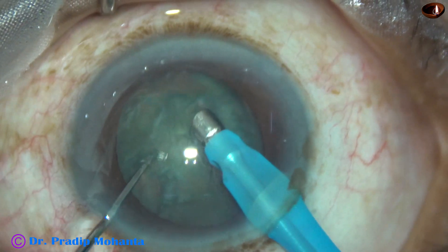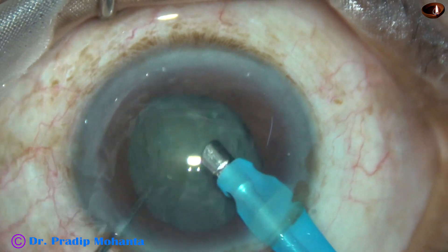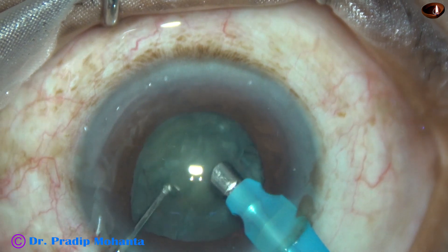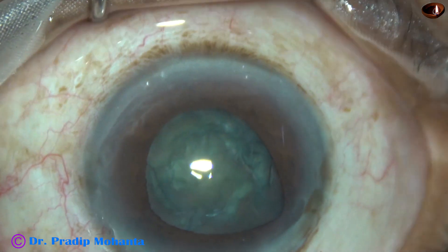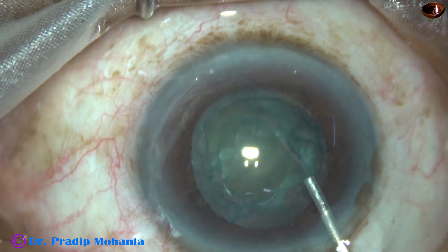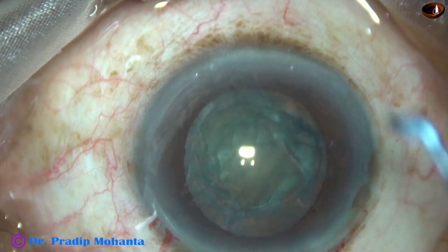I go in, aspirate some superficial cortical lens matter, and the pupil becomes small. Not only that, the iris tends to prolapse through the side port. I have decided what to do. The iris tends to prolapse through the main wound also. I inject visco — this is viscomydriasis.